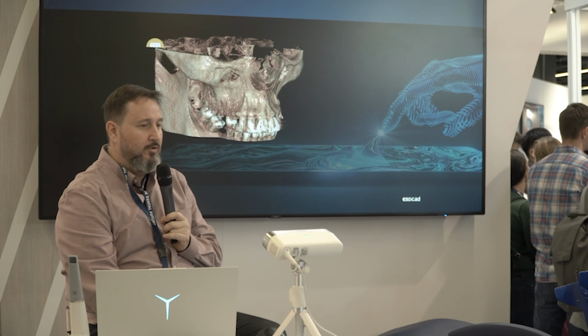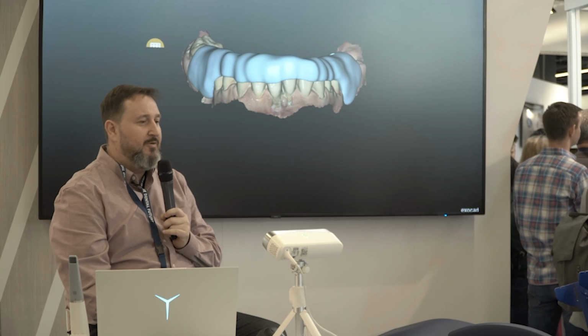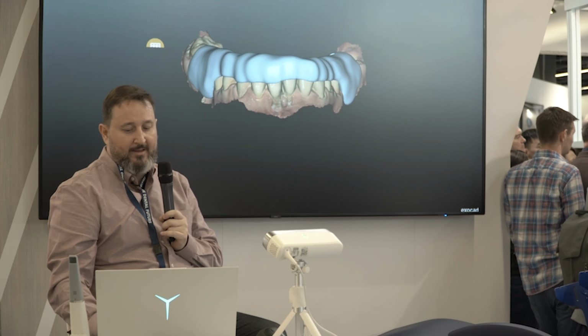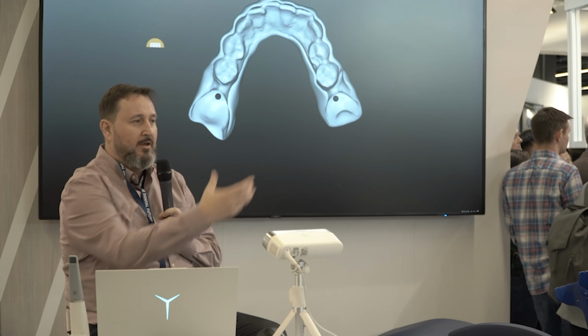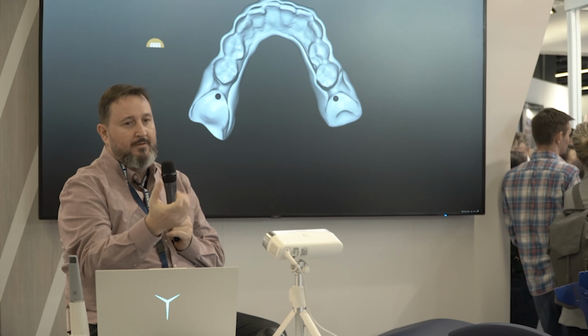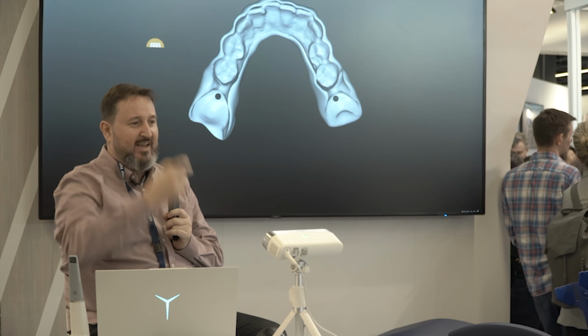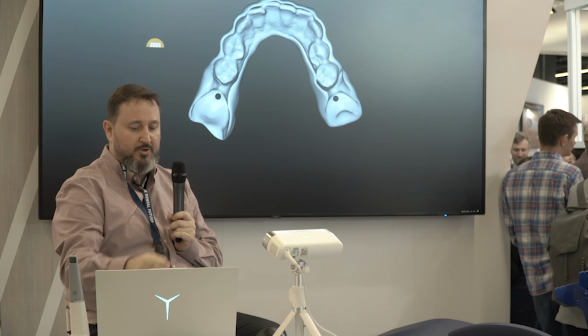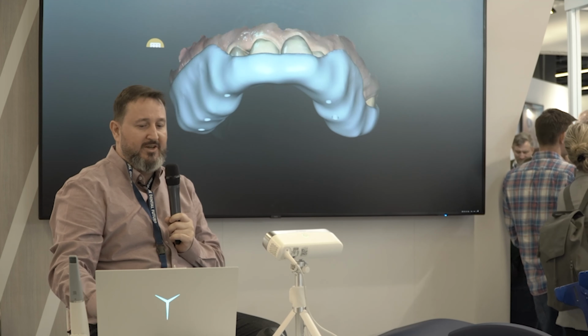Okay, and now going to the pilot guides. It's very easy. You can make it just with the splint software from exocad. Just make a splint and, getting the design you've made with the planning software, just with the vertical axis, put it into exocad and make a Boolean operation.